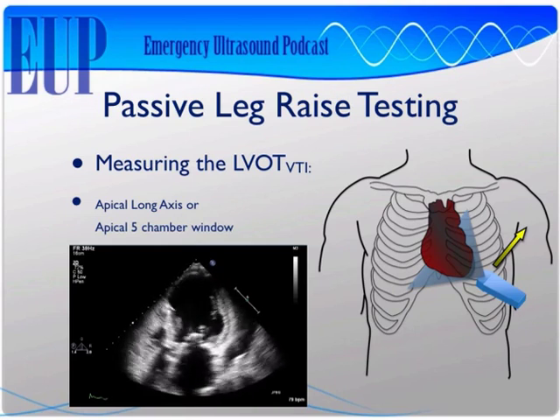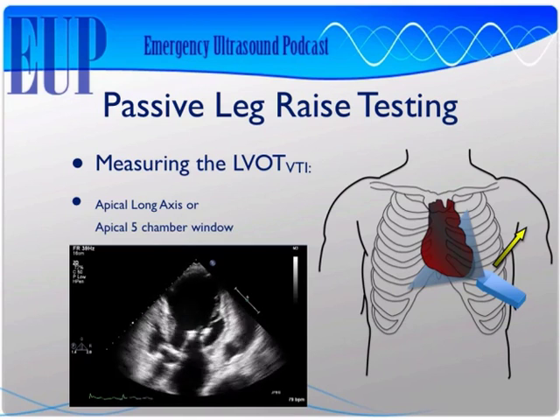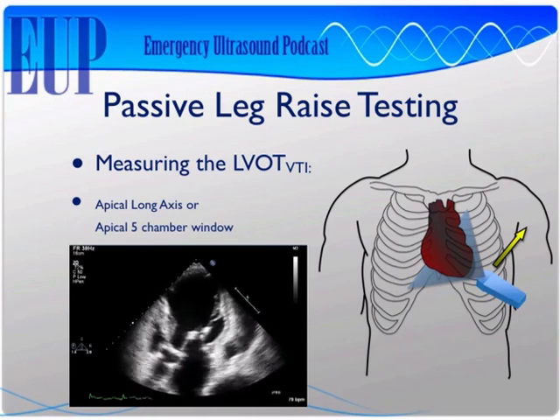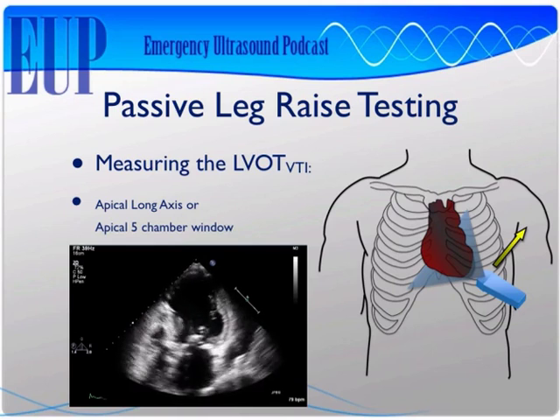And to do that, all you really have to do is get that apical four-chamber window, and it's just small twists of the probe that are going to open up that left ventricular outflow tract or switch you over to the apical long axis.